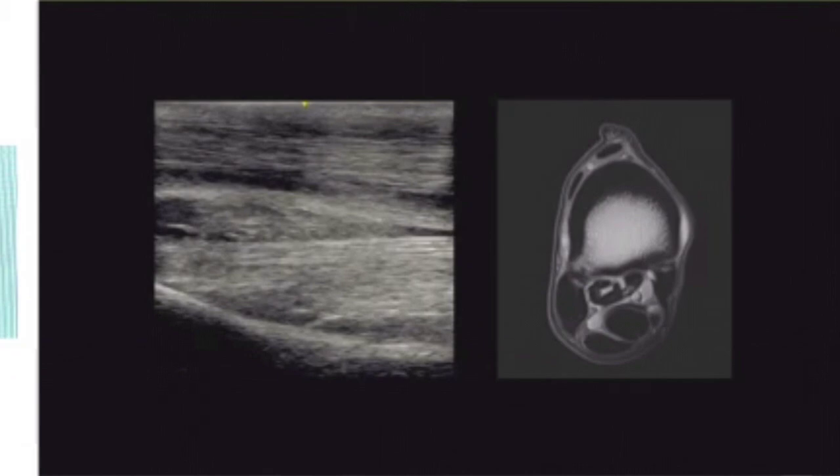A couple other things to think about in long axis. Just remember, it's a bilobed structure, and it's not uniform across the dorsal margin. So depending on where your probe is, you might not be hitting the actual inline fibers. You might be hitting a gap where there's just connective tissue in between the two bundles.